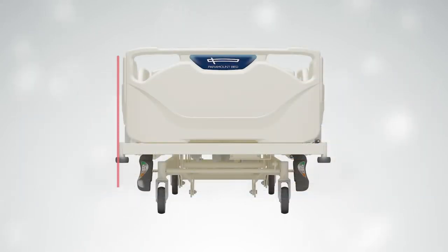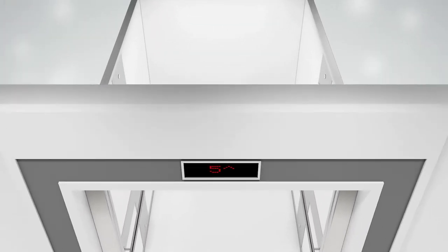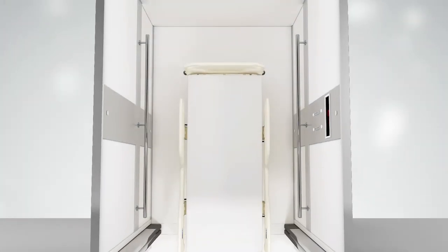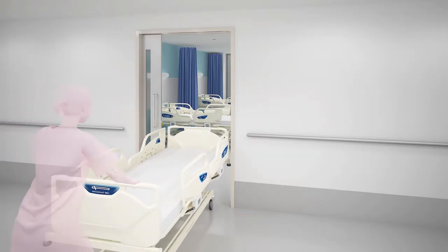In addition to providing a comfortable surface on which patients may recuperate, the compact design of the overall bed facilitates greater ease when maneuvering around sharp corners, through narrow entrances, and into elevators.